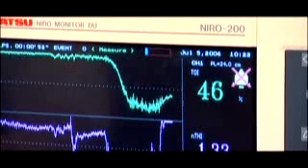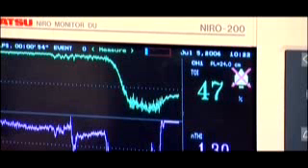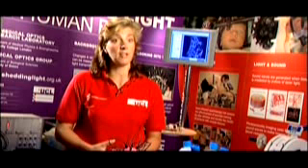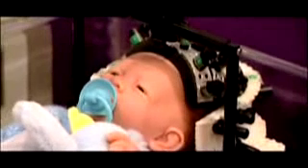Our exhibit is all about new technologies using near-infrared light sources to look through much wider sections of tissue. So we're able to look through whole sections of brain, particularly the brain of a premature infant, and also through the muscle and also through the breast. The main advances which have led to this area becoming so interesting are new laser sources, for example, new detectors, as well as new computing technology which enables us to perform types of imaging that previously we're not able to do.